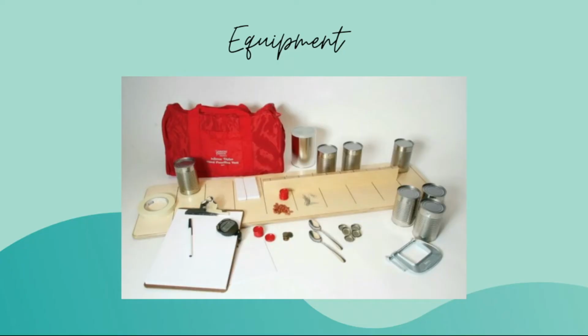The tests are typically completed with standardized equipment that can be administered to occupational therapists for use with their patients. The test kits include the instructions to complete the test, the items for the subtests, a carry bag, and a pad of 50 blank record forms for the assessor to record times. This test approximately costs $300.